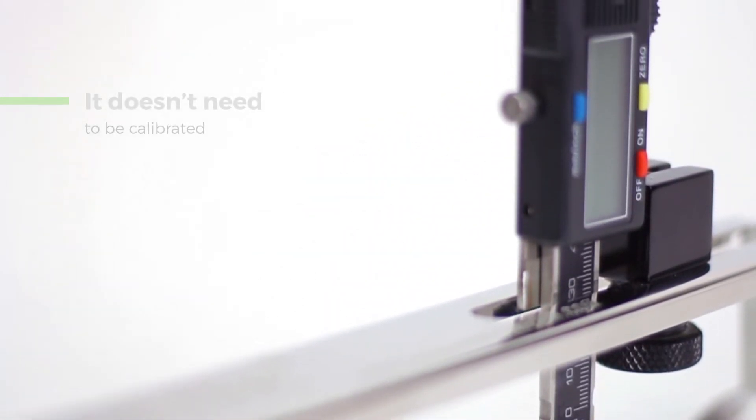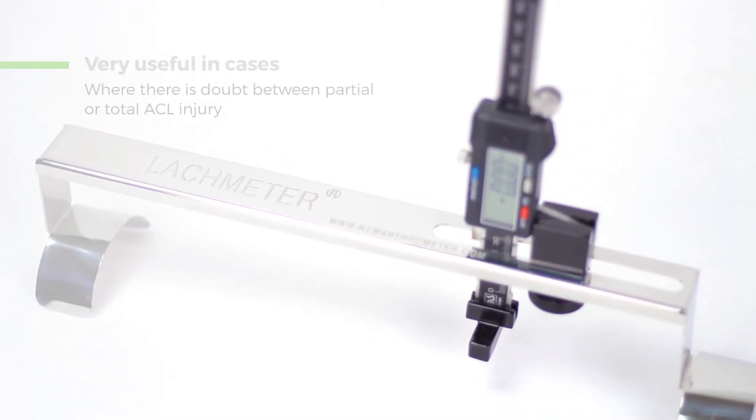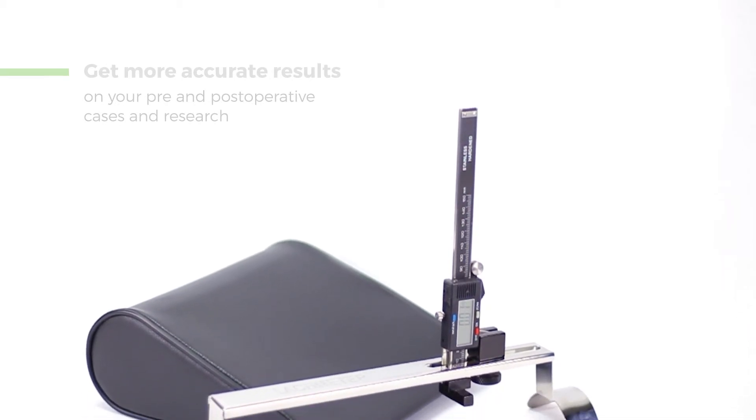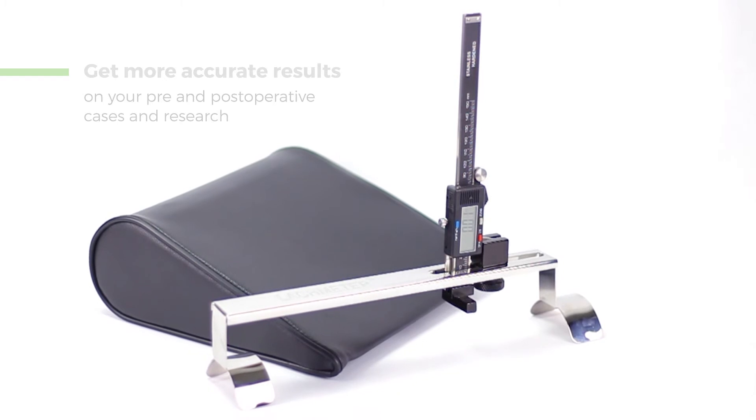The Lachmeter can be very useful in cases where there is doubt if you're handling a partial or total ACL injury, comparing both knees. Get more accurate results on your pre- and post-operative cases and researches.